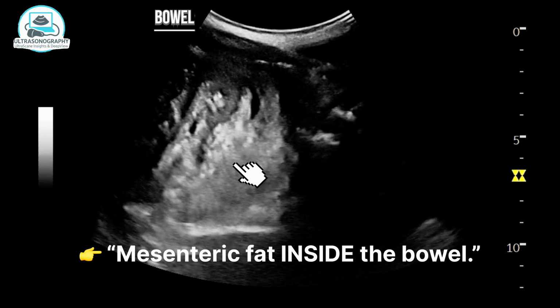This is exactly where most people get it wrong. In children, intussusception can be idiopathic and sometimes self-limiting, but in adults, especially when the colon is involved, intussusception is never innocent. Adult colonic intussusception almost always hides a pathological lead point, often a tumor, polyp, or malignancy, and missing this diagnosis can delay life-saving surgery. Even if bowel wall layers appear preserved today, and even if there is no free fluid at this moment, this is still a ticking clock scenario.